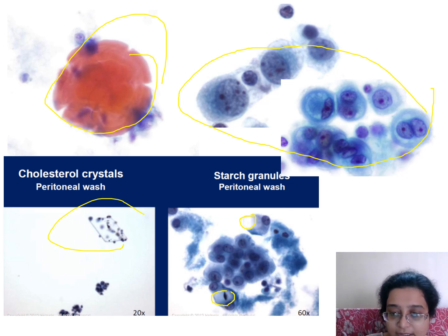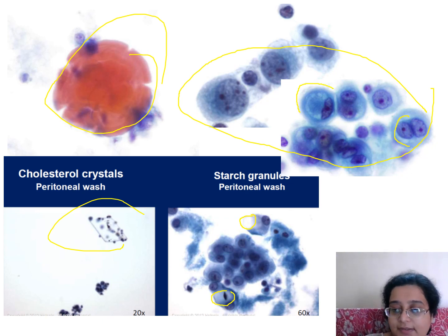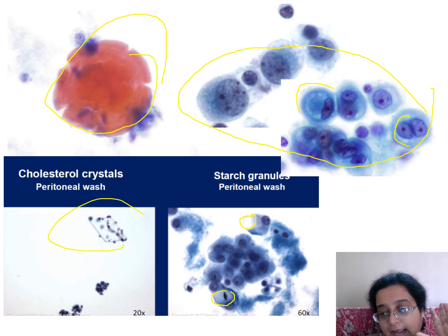because when you study Grays, they are going to tell you that a mesothelial cell has this clear area around the nucleus, it can be binucleate, the cytoplasm may have these frizzy borders. I look for a cluster always. All that said and done, I'm giving you a practical tip. I look for a cluster and then I look for mesothelial windows. And if I am getting few clusters with mesothelial windows, I am going to presume this is reactive.